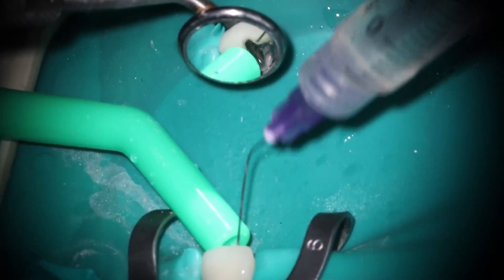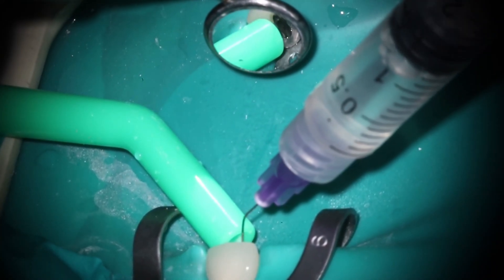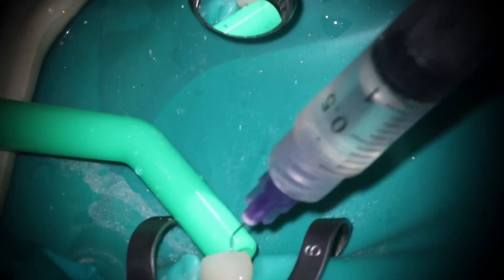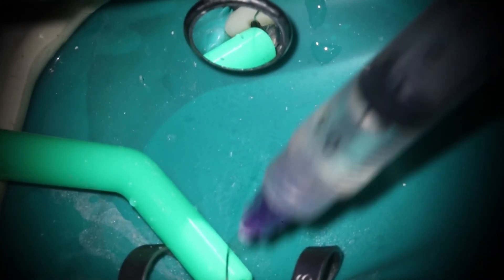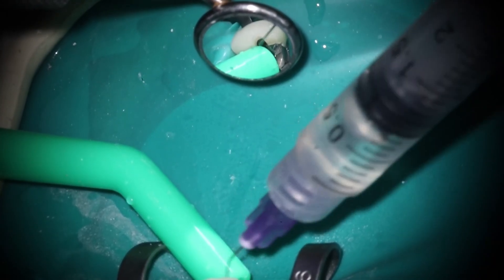What we ended up doing here — there was a little more infection than anticipated, so I ended up medicating it. They had already kind of started it and she was in a lot of pain, so we ended up doing a quick open and medicate. The thing to take away here is the importance of using the cone beam to map out your access.